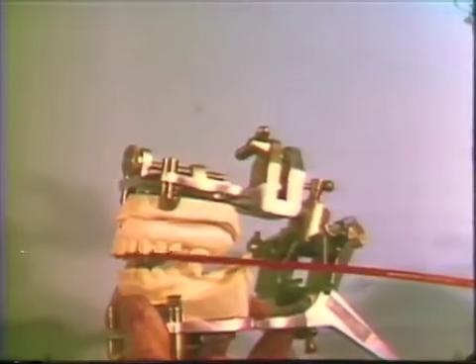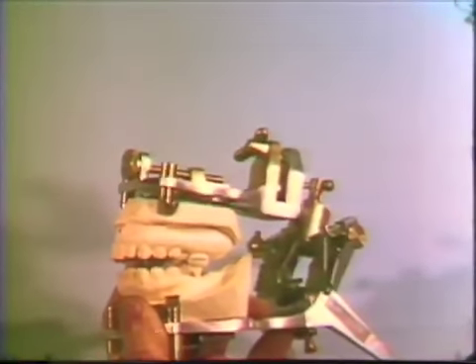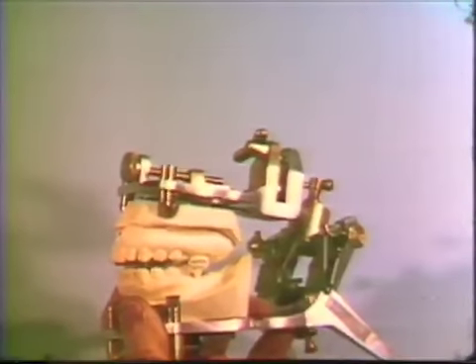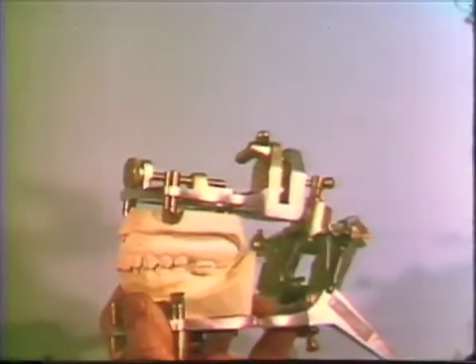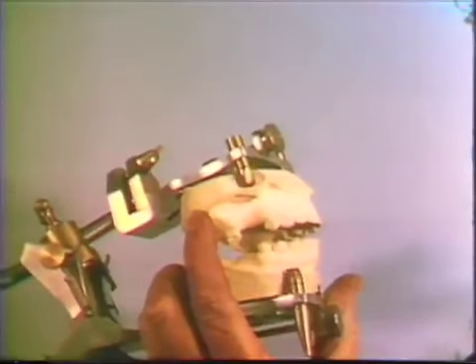The gross reduction of the crown in tooth number 14 to achieve interocclusal space necessitates devitalization procedures. Crown and bridge procedures are necessary on the remaining posterior teeth to permit an opening of 1 millimeter and establish an arbitrary posterior occlusal plane, as well as to achieve other desirable effects.